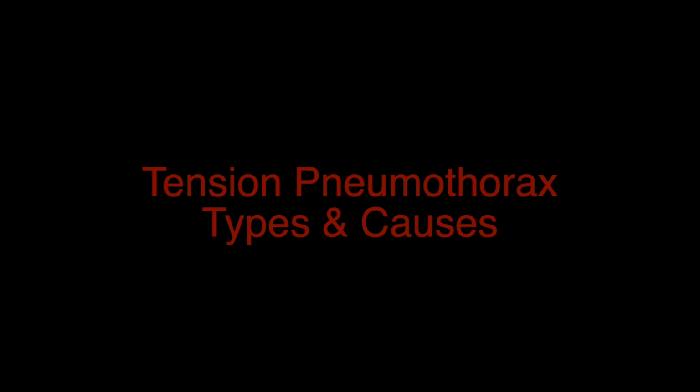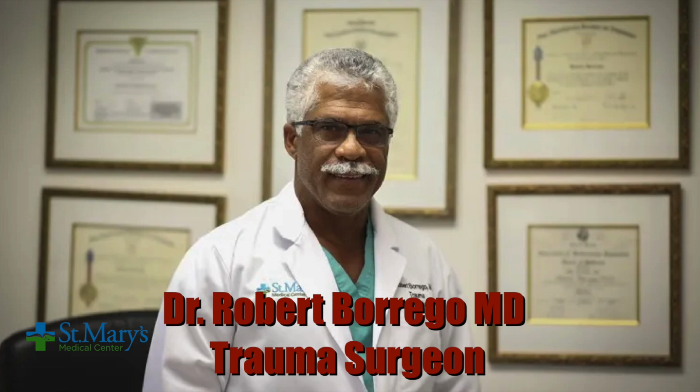Today we're going to talk about tension pneumothorax. We were able to bring in Dr. Borrego from St. Mary's Hospital to go ahead and show us how to do this in the landmarks. One of the things I want you to be mindful of is there is going to be a change in the protocol because of this education that we're gaining.